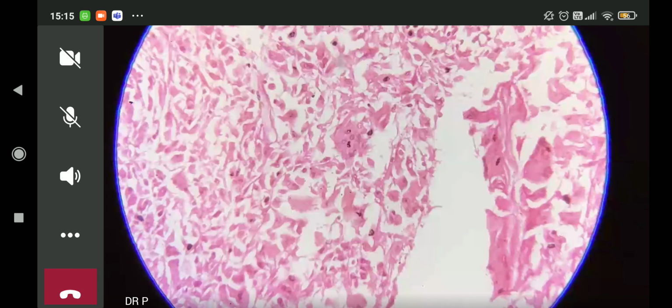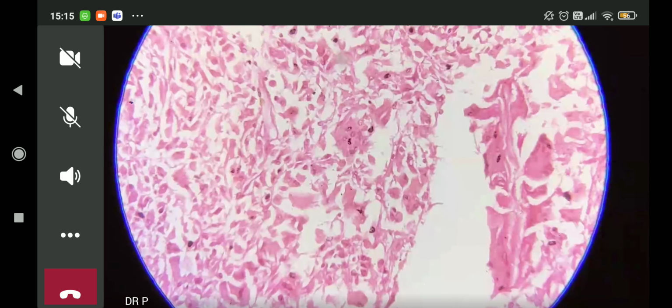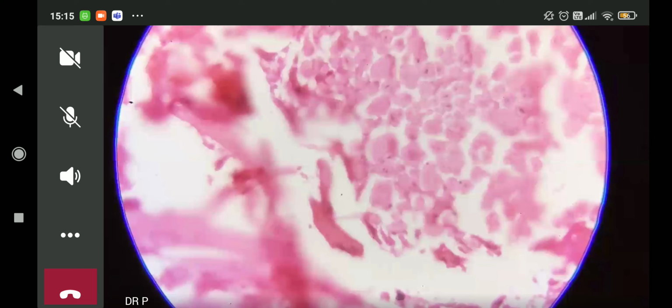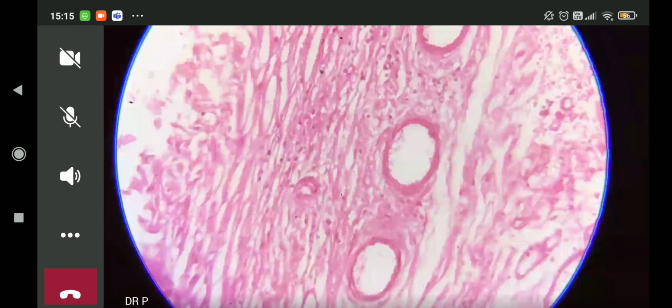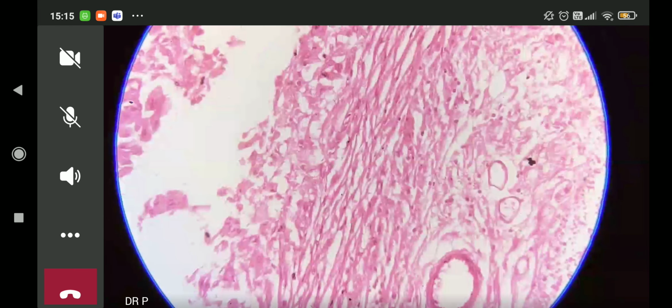Back to the suture material. Inert looking, absolutely non-biological, coming into the area of the interface, arterioles, again foreign body giant cells. Around the foreign body giant cell you have a few histiocytes, and that's about it. I hope it's clear.